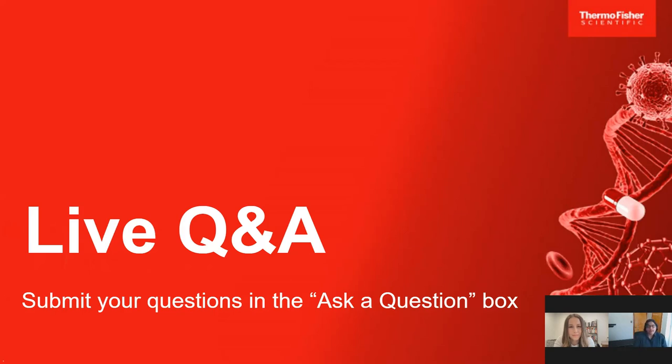So the main consideration for blocking is what you are trying to do. If you are using a goat antibody, which is raised in a goat, and you want to do multiplexing, then use goat serum as a blocking reagent. If you are using an antibody which is raised in a donkey, use donkey.